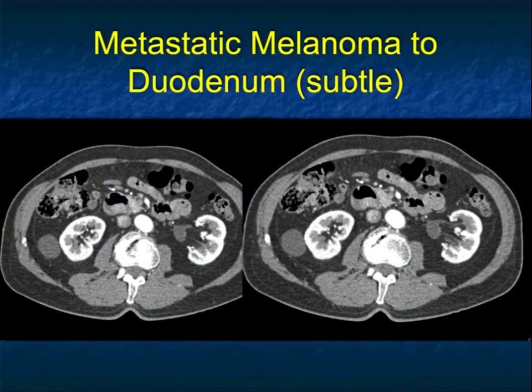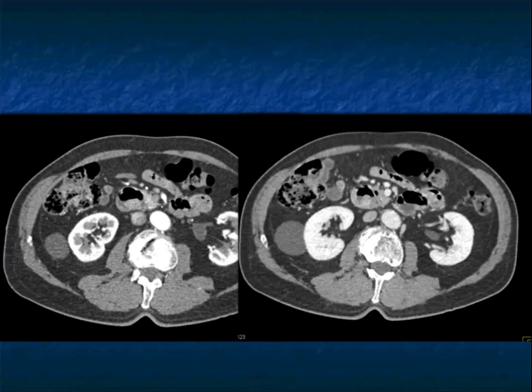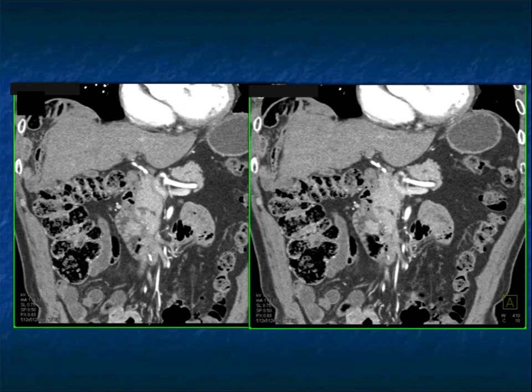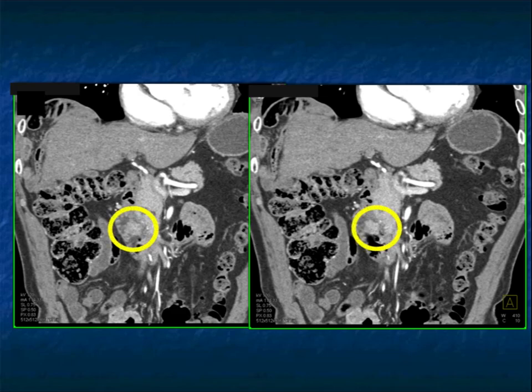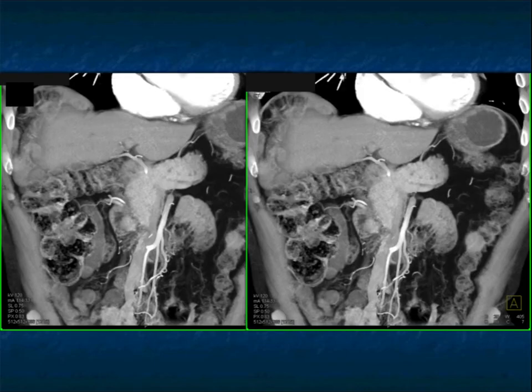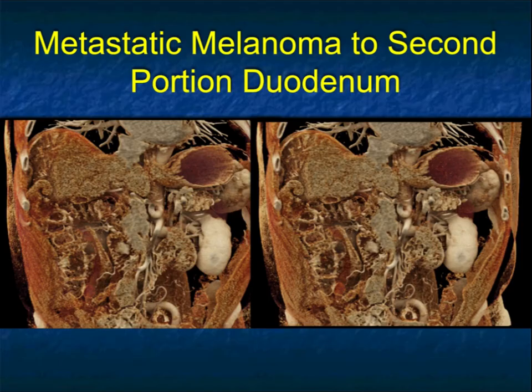Sometimes lesions are subtle. Look at the duodenum — if you look really carefully, there's a one centimeter lesion on the posterior wall. It's easier to see on the coronal view, where the lesion is a bit over a centimeter and is vascular. That was metastatic disease in the patient's duodenum. If you had said a duodenal carcinoma or duodenal GIST, you might have been right, but you've got to think about METs, especially if the patient has had a prior primary. Cinematic rendering really makes that melanoma stand out in the second portion.